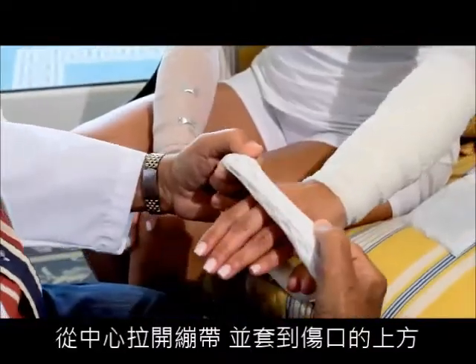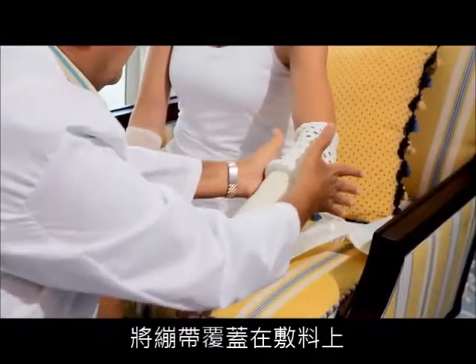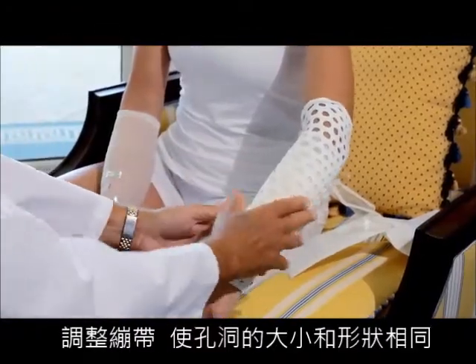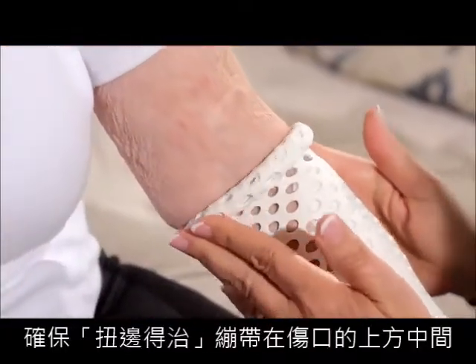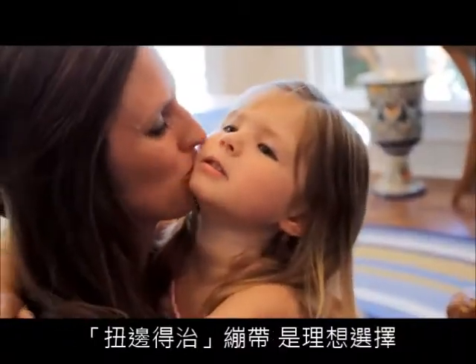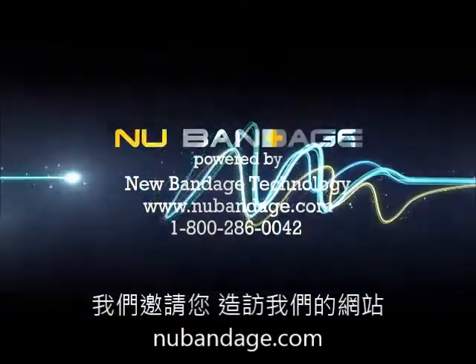Stretch the bandage from the center and place over the affected area. Roll the bandage over the dressing. Adjust the bandage so the air holes are equal in size and shape. Ensure that New Bandage is centered over the affected area. New Bandage — the ideal choice. Visit us at our website at newbandage.com.